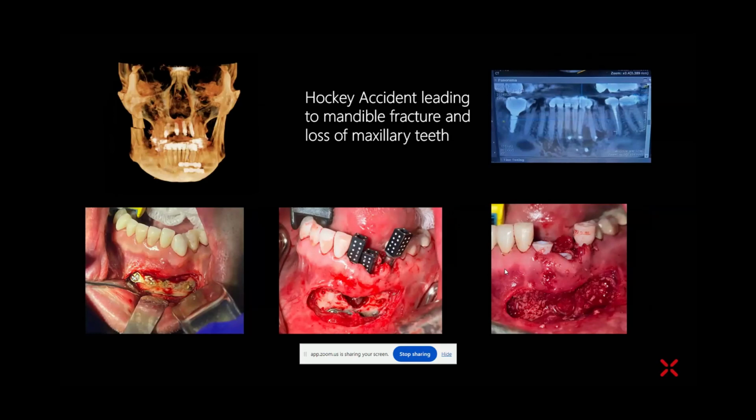That way, with the use of photogrammetry, I was able to place the middle implant somewhat subcrestal, actually quite a bit, because after we removed the screws and one of the plates, we found there was a massive defect. Nonetheless, I wanted to place 3 implants, because just in case we lost one, I wanted to have at least 2 implants. We removed the plate and cleaned out the infected area. It was actually found to be just infection within the teeth from the screws that had come loose.